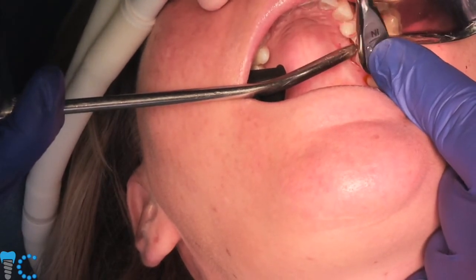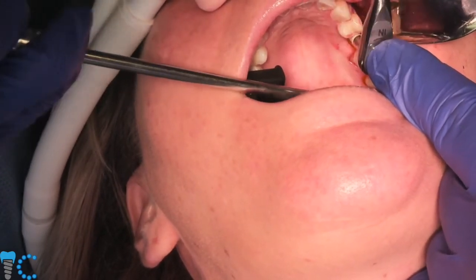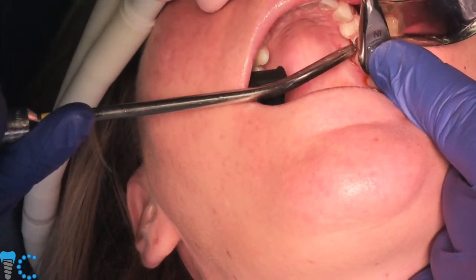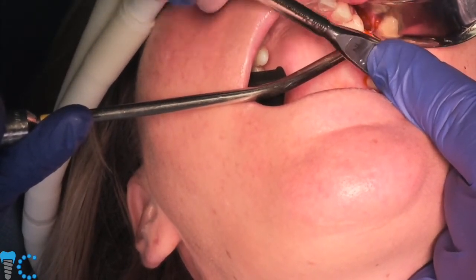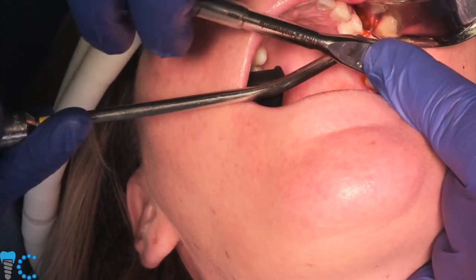We got a question from someone. They actually want to know about the implant price and drilling kit. We have one of the representatives from Z Systems here with us, Kelly. Kelly, can you give us an idea of what they can do and get that information? Absolutely. You can go to our website, or you can contact one of our reps to get information on pricing. We always have promotions and specials.